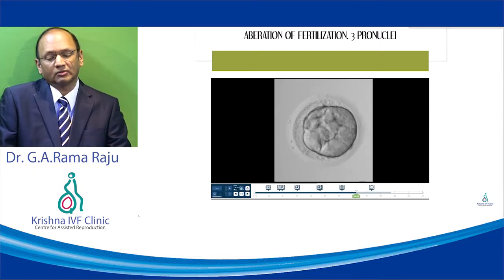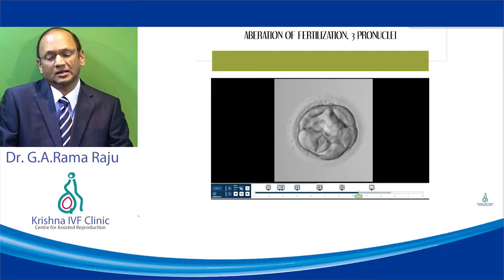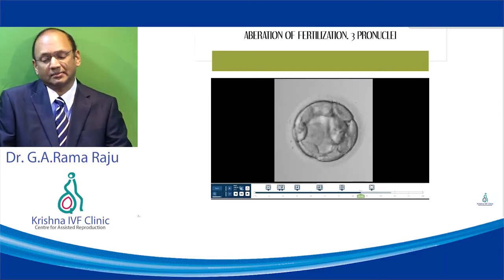And all of us, when we look at these photographs, will say it's a beautiful blastocyst, and we did not get a pregnancy.